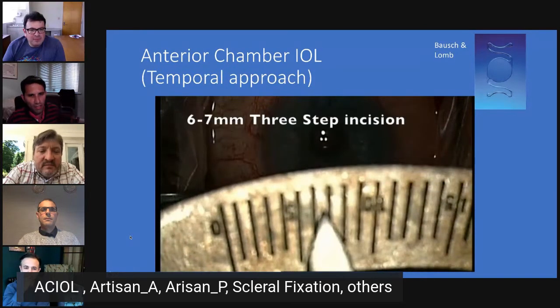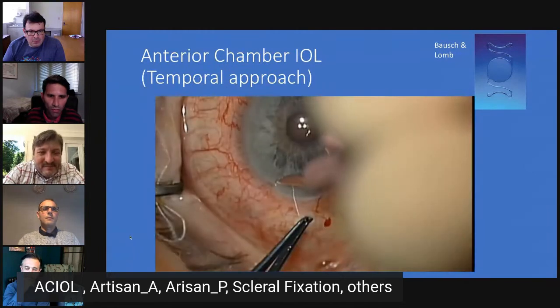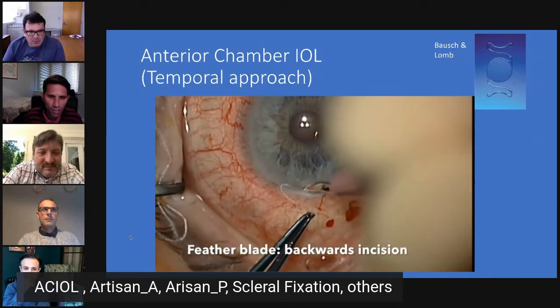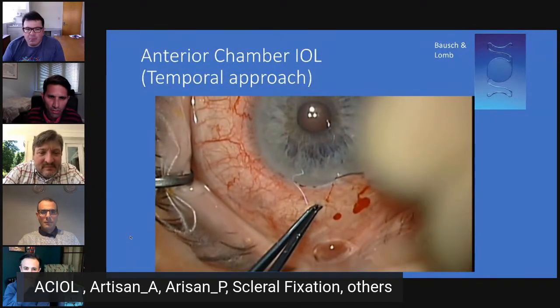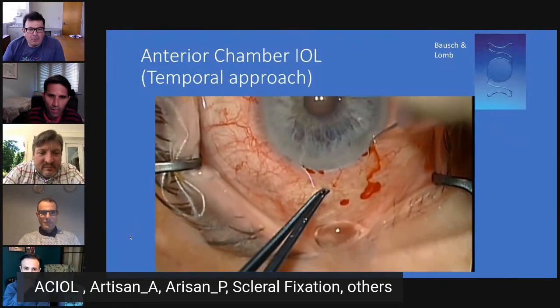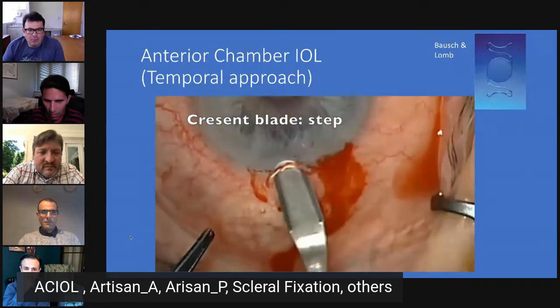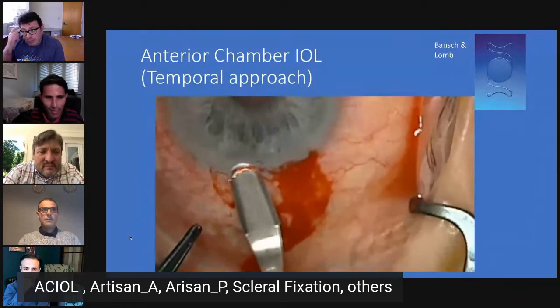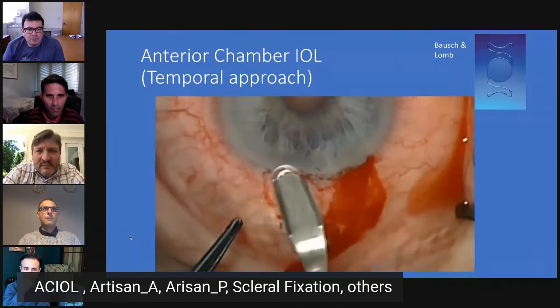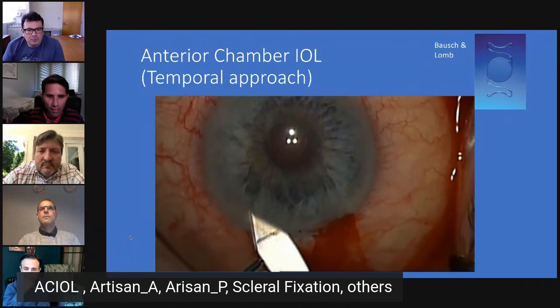So I'd like to make a large incision. So this is going from temporally. I think we've obviously been trained the same way, but I like to make a large, proper three-step incision. So with a backward-facing feather blade to make an incision. And then I like to use a crescent blade to really make a very well-defined step in that wound. If you make these wounds properly, they're less likely to leak.